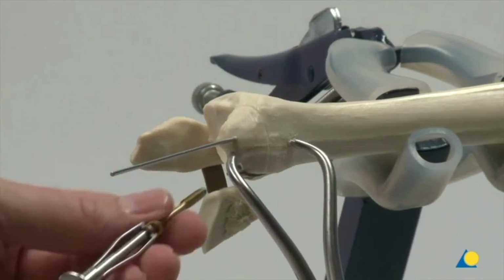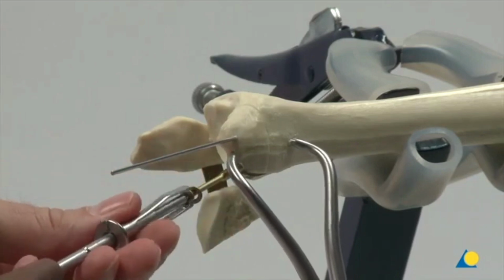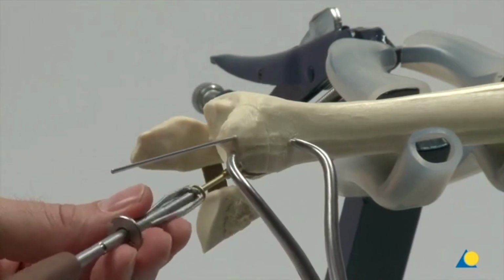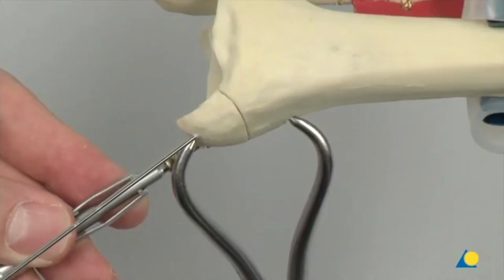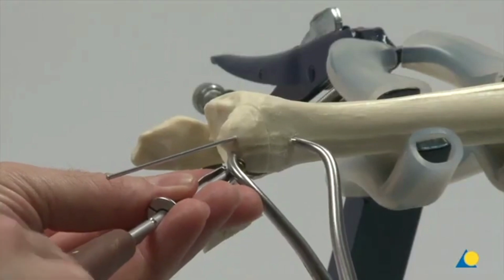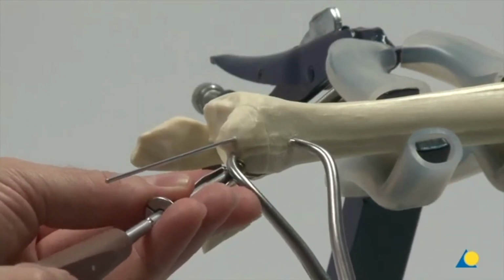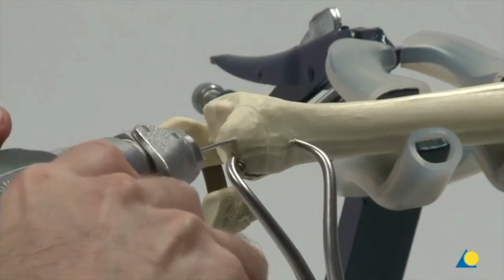The 4.0 mm partially threaded cancellous screw is inserted with a washer to achieve interfragmentary compression. The K-wire is removed.